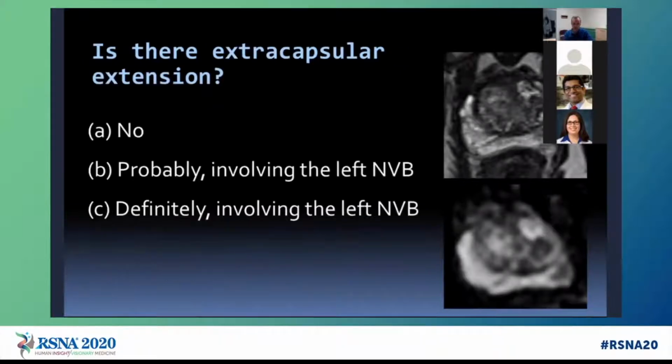Okay, we'll go on to the questions. This is an audience response question. It's a little bit equivocal, and sometimes we put that in our reports that we're not sure. And often, actually, I find it depends on what the pathology comes back as. If this is a particularly high-grade tumor, then your suspicion levels would be raised. Obviously, if you're interpreting the MRI at the time of not having the pathology, then that's something that could be revisited once the biopsy has been done.